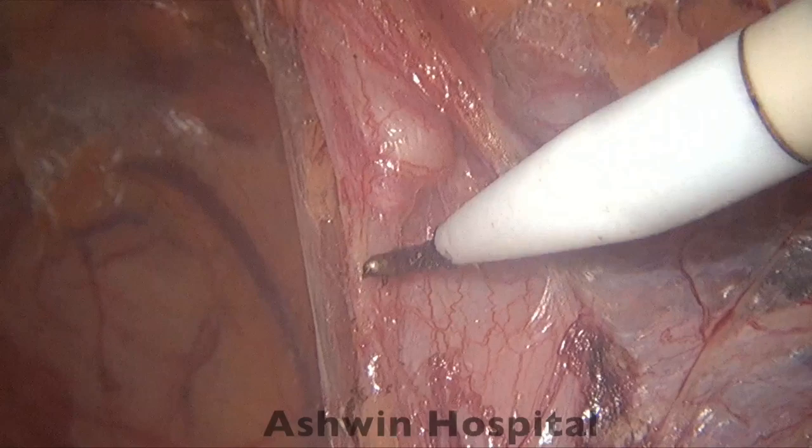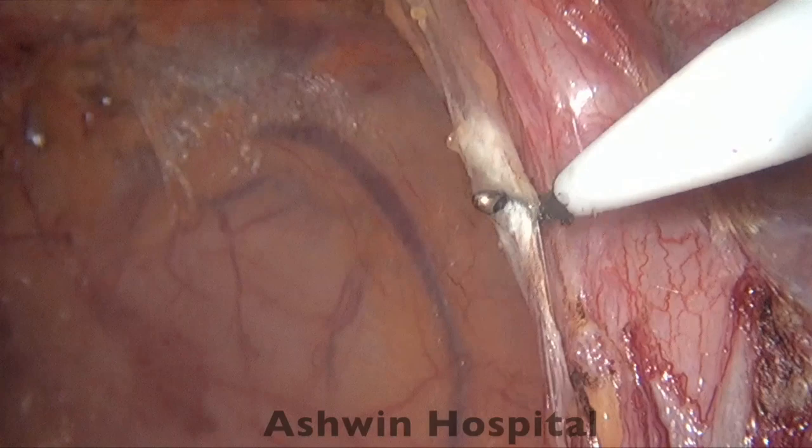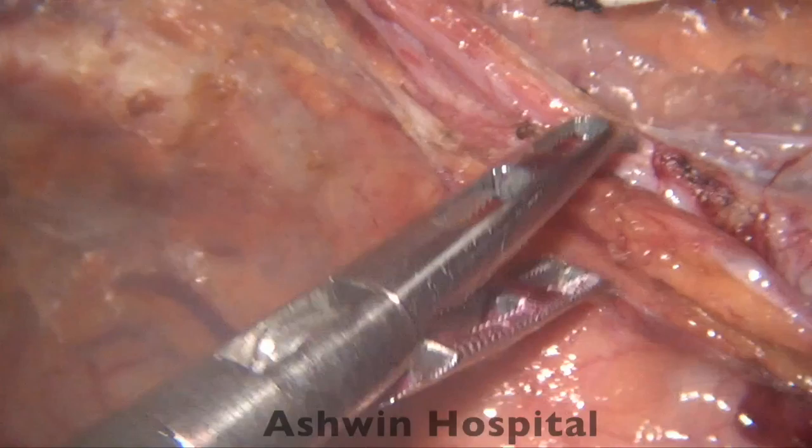So here you can see we are using the cautery in a precise manner. You can see the vas is present just to the right of the instrument, and here we are trying to dissect very close to it but making sure there is a good margin of safety so that we don't cause any thermal injury to the vas.